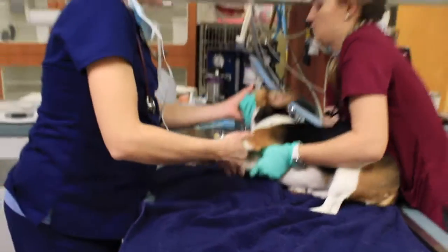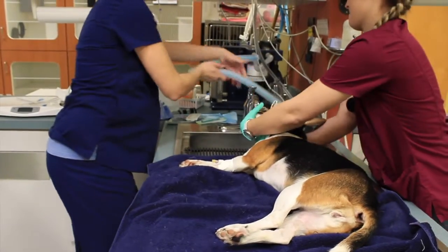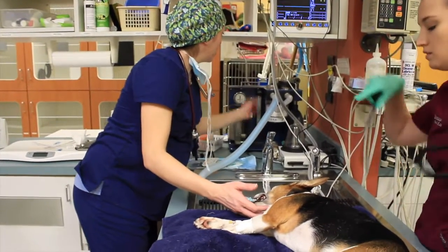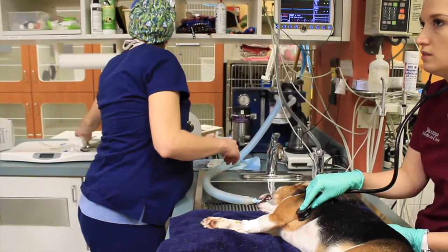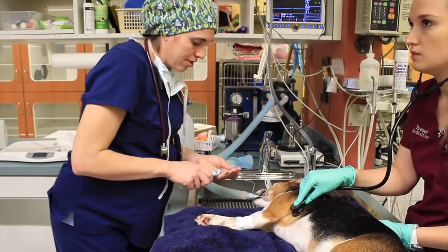We will lay her on her side, hook her up to the oxygen and anesthesia machine, and then check the seal on our tube to make sure it's a complete seal and that no water can pass it during the procedure.